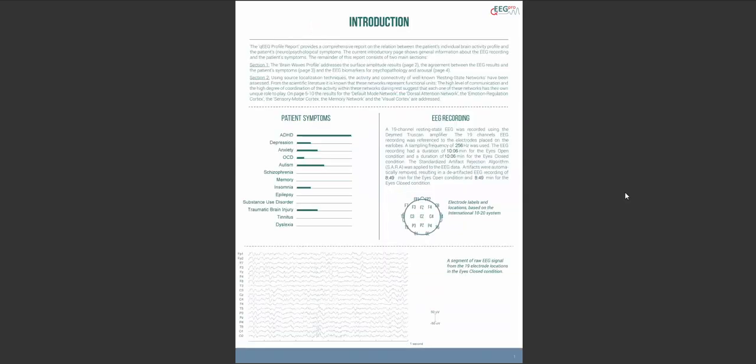The introduction page starts with an introductory text about different analysis in the report and will give you general information about the patient's symptoms and the EEG recording. The patient's symptoms can be based on the client questionnaire that has been filled out by the client or a relative of the client or it can be based on the therapist's rating scale which has been filled out by the therapist.